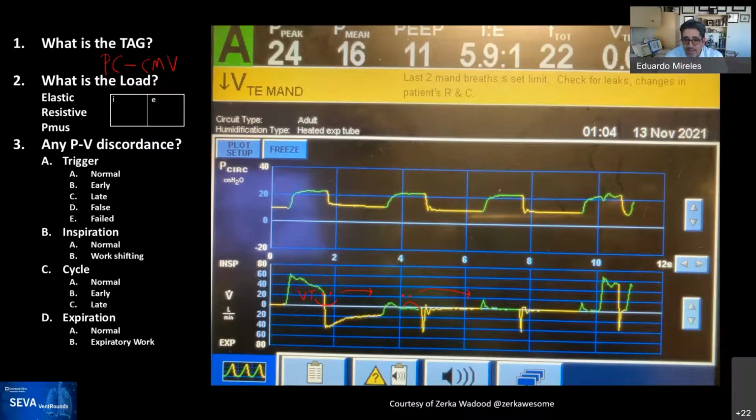Thank you, Tim. So the next pressure would go up, right? And in the next breath, because this didn't achieve the tidal volume, you would actually have an even higher pressure to try to achieve that. So if this was adaptive, you would see the pressure going up, up, up to try to achieve the tidal volume that you're going after. Make sense? All right. Great job, Tim.